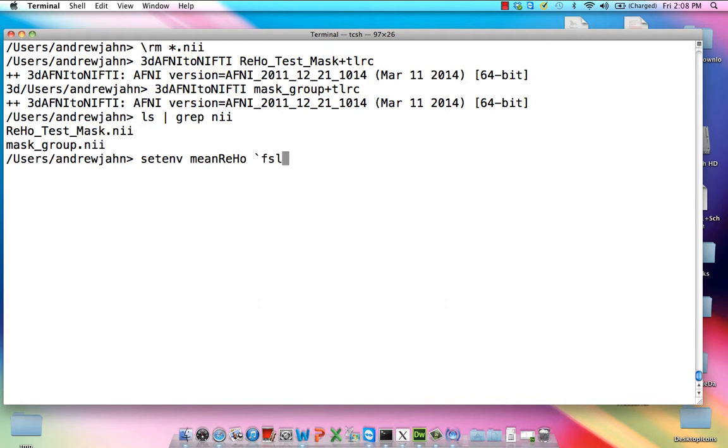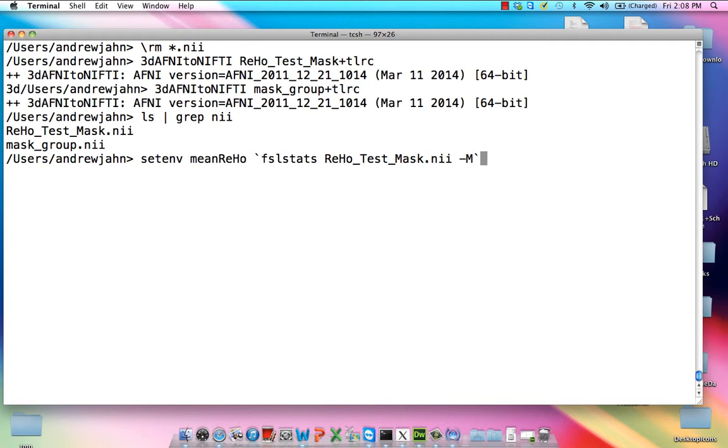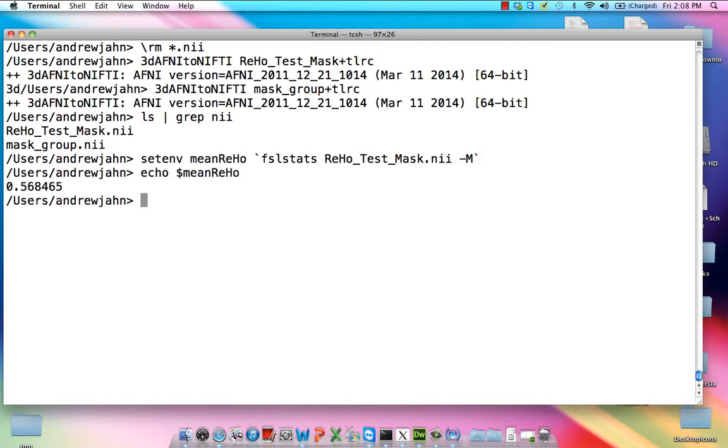And I'm going to put into that variable the output from FSLStats, RehoTestMask.NII, and a big M. Big M, that option just means only do this calculation for non-zero voxels. I echo what's in meanReho. It's 0.568, which is basically the same thing that I got with AFNI.